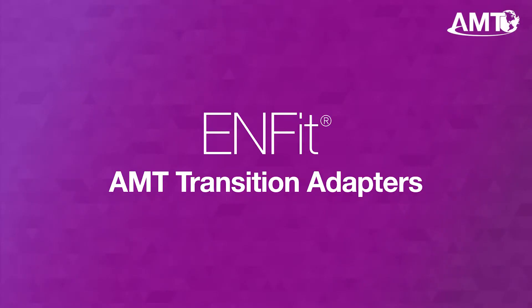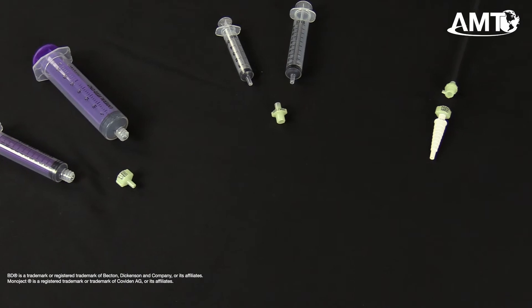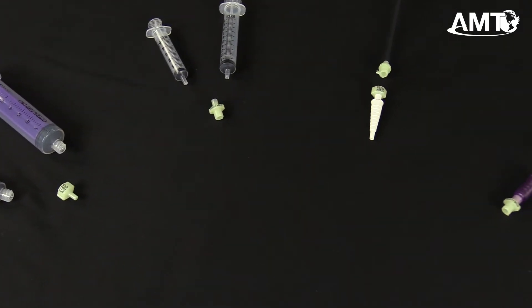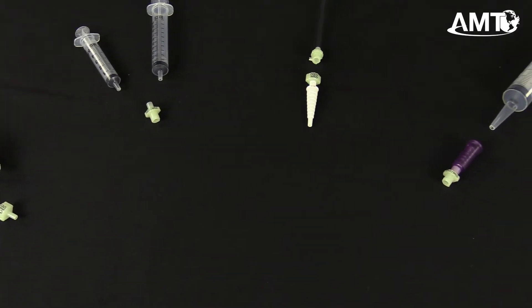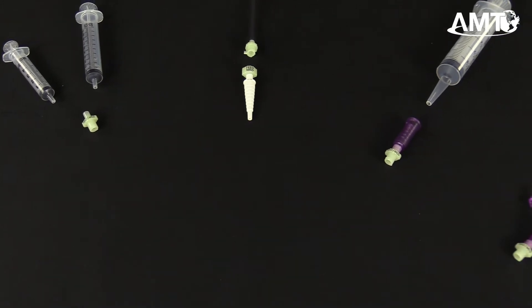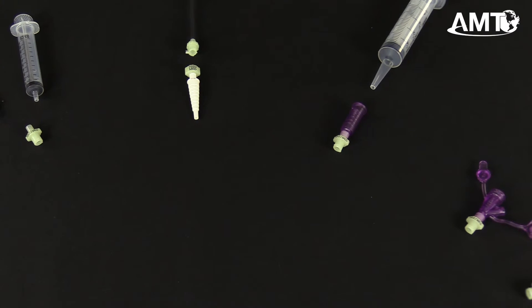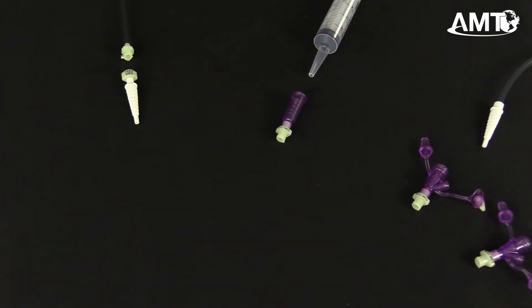Hello, and welcome to AMT's educational video series. Today we will show you AMT's ENFit transition adapters. AMT has been manufacturing ENFit-ready products and accessories since July of 2016. AMT will be providing you with the best options to make this global industry change as simple as possible. Our ENFit transition adapters provide forward and backward compatibility, allowing you to choose what works best for you and your patients.